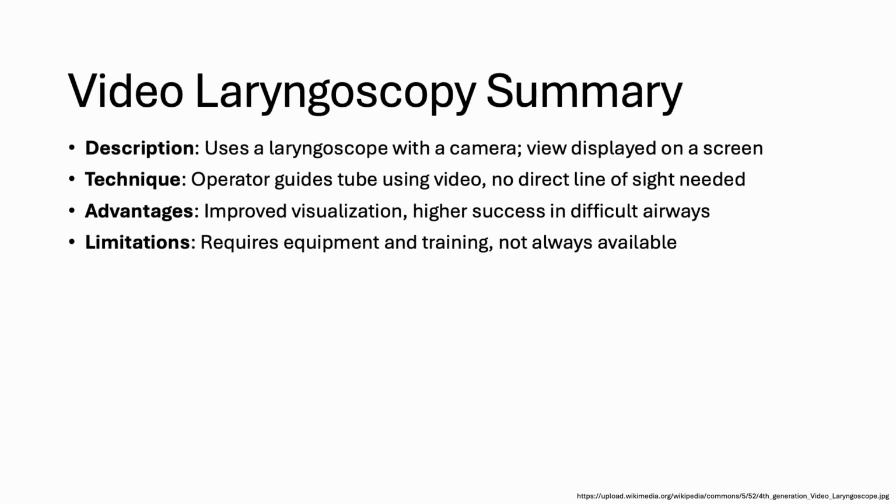In summary, video laryngoscopy offers significant advantages in terms of visualization and success rates, particularly for difficult airways. However, it requires specialized equipment and training, and operators must be comfortable with the indirect nature of the technique.